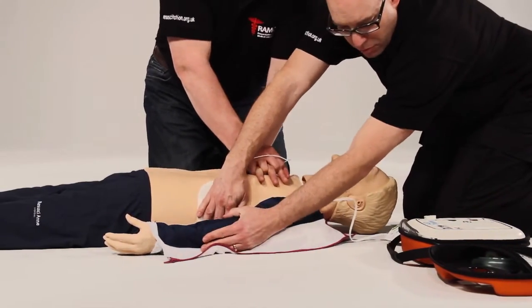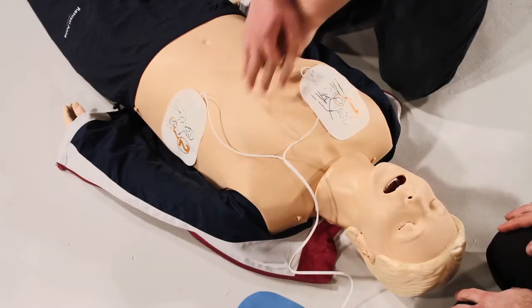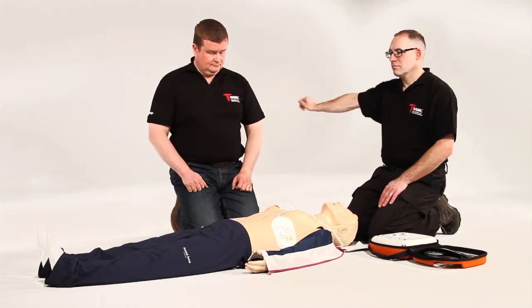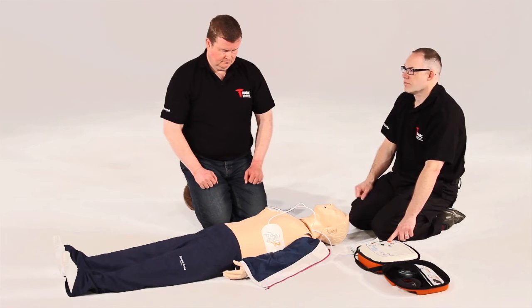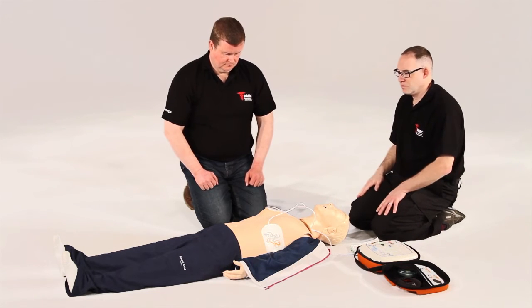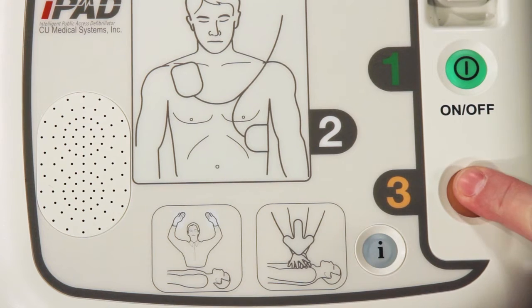The iPad SP1 AED will then prompt you to ensure that no one is touching the patient — stand clear. If a shock is advised, the iPad SP1 AED will charge to a predetermined level and advise you to once again check everyone is standing clear, and then to press the flashing orange shock button.